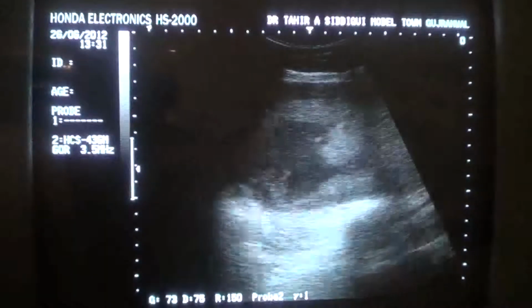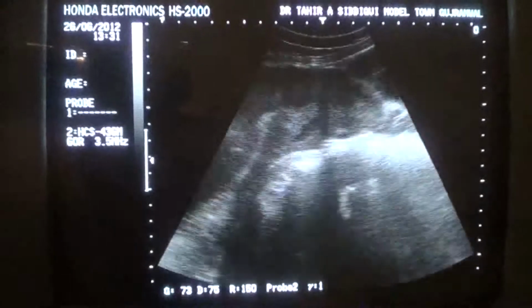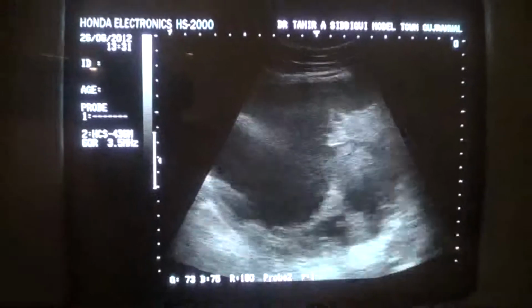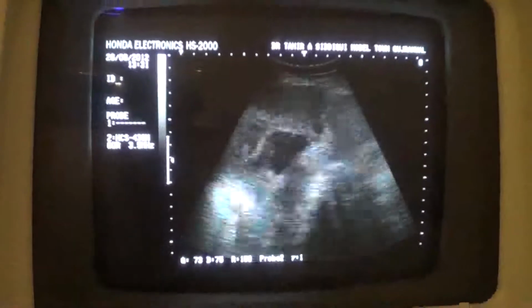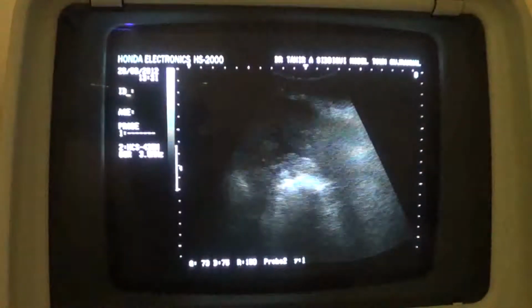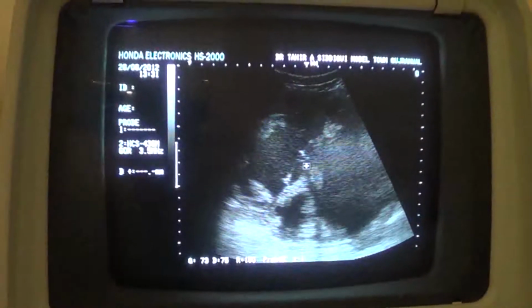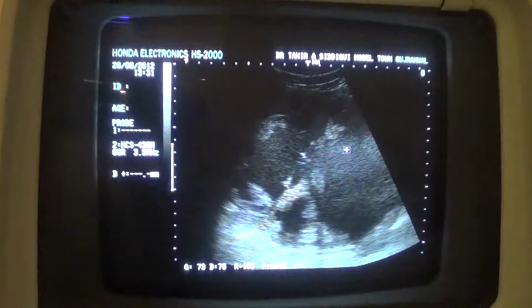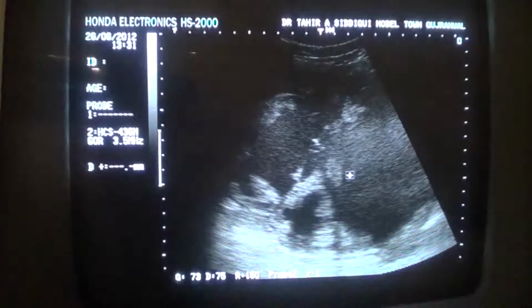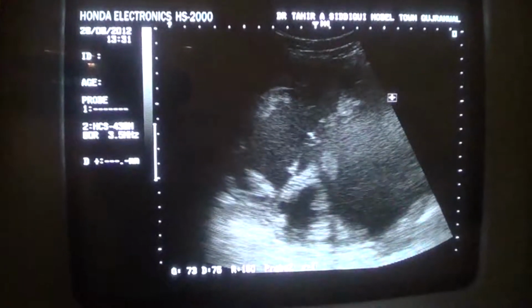Rather, bleed with clot, because these sand-like particles that you are seeing are the part that is fresh blood. This echogenicity, the sand-like particles within this cyst, represents the fresh bleed, whereas this is the bleed converting into clots scattered throughout the cystic area.